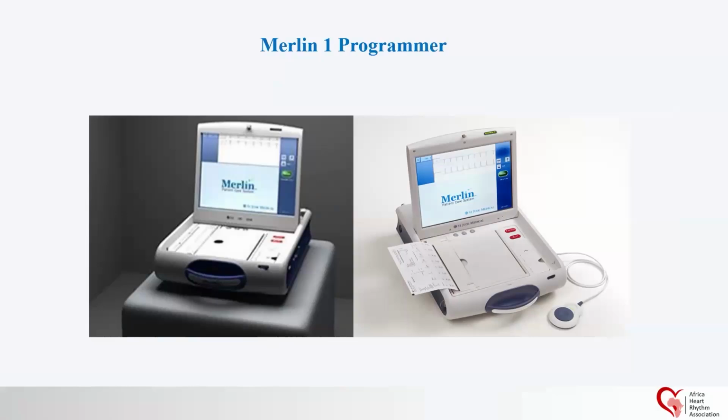We check all parameters. We do some tests to check if we have a good value for the three parameters that we set before: threshold, sensing and impedance.